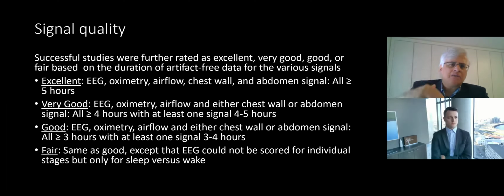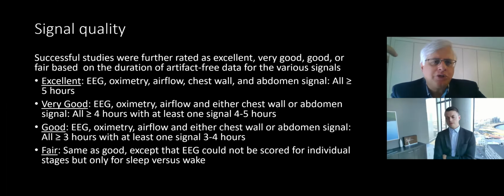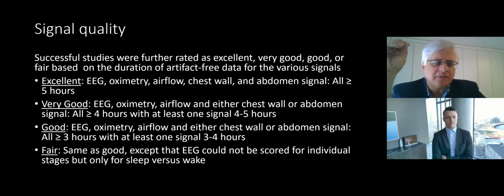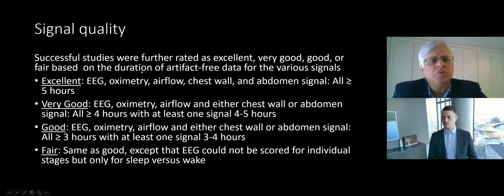We then went on to say, okay, we can do successful sleep studies at home with EEG. How good is the signal? And I would show you some of the recordings we had. So we rated them. We rated each signal as excellent, very good, good, or fair, based on the duration of artifact-free data.